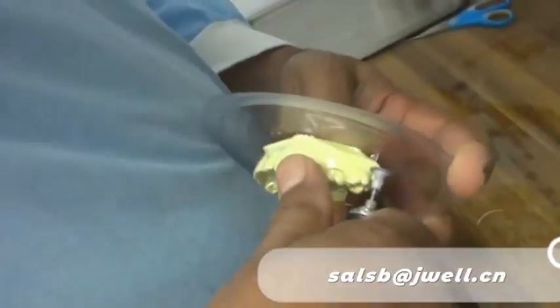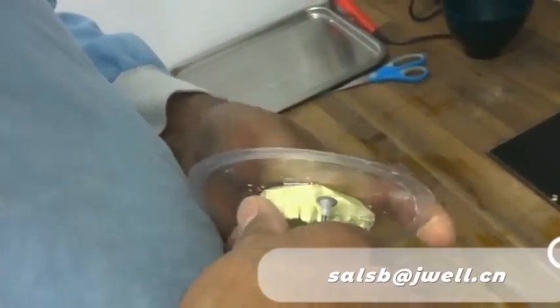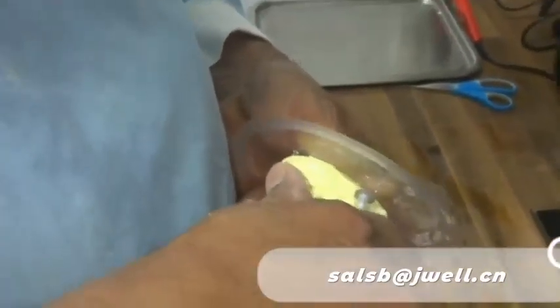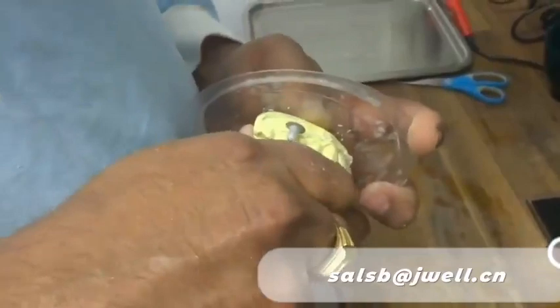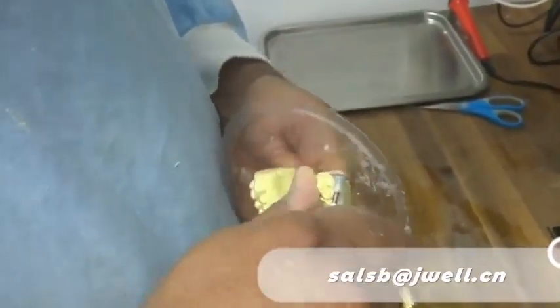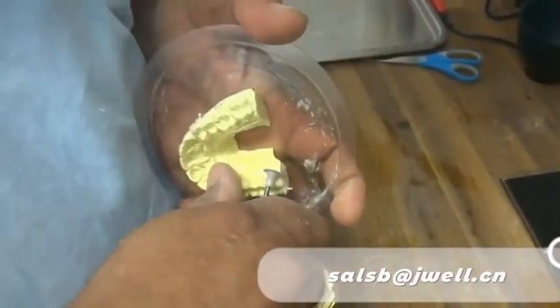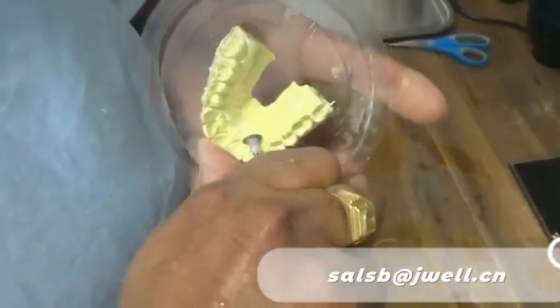So once that comes out of the machine, we come to this stage of trimming, and basically turn that up a little bit. I use this lab handpiece, and I trim just below the crown level, gingival level, all the way around. Now, if you're watching at home, don't try and do this without some experience, because it's very dangerous on your fingers. And do wear eye protection in case these little hot bits of Zenduro material flick up onto your eyes.